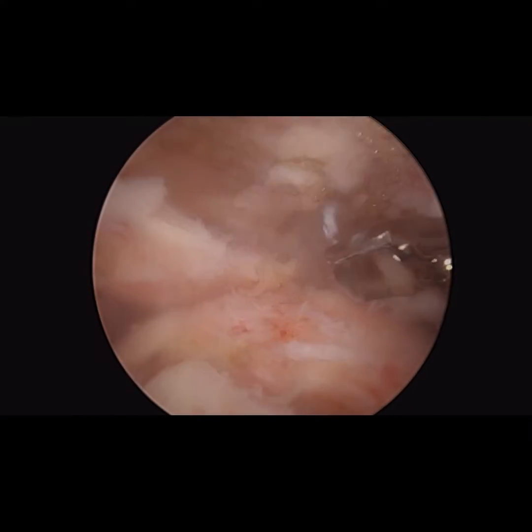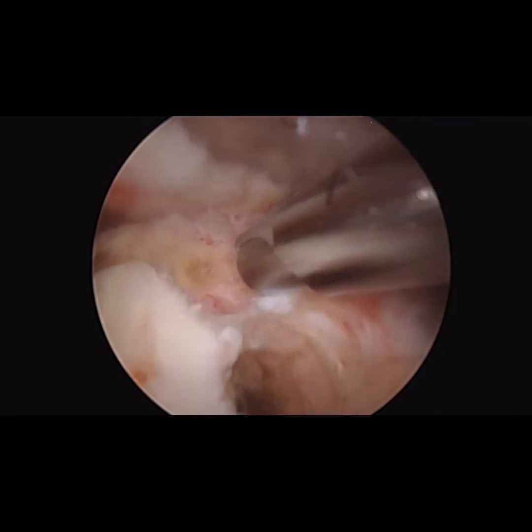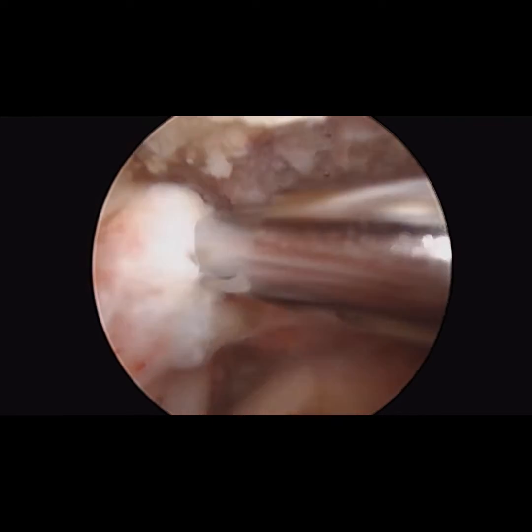I then removed the PEEK anchors, which left large defects in the bone, which really prohibited any other type of repair, such as a superior capsular reconstruction in a case like this.